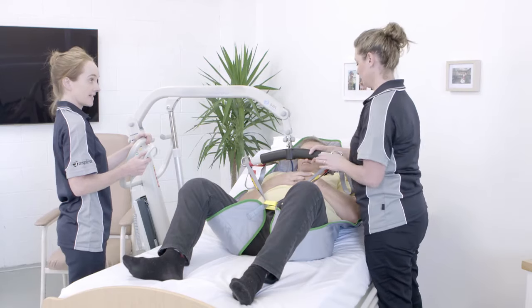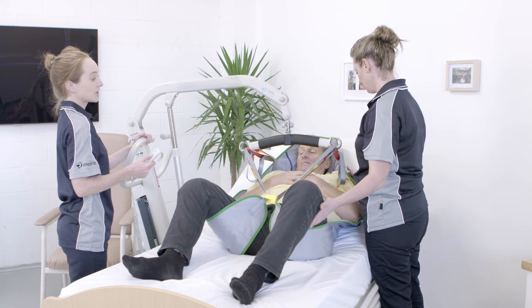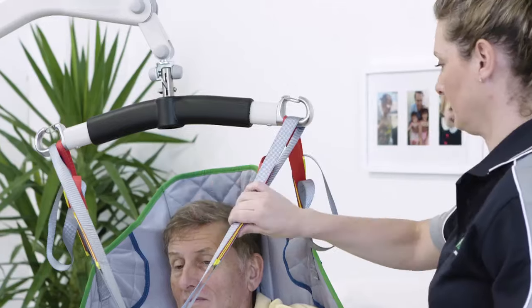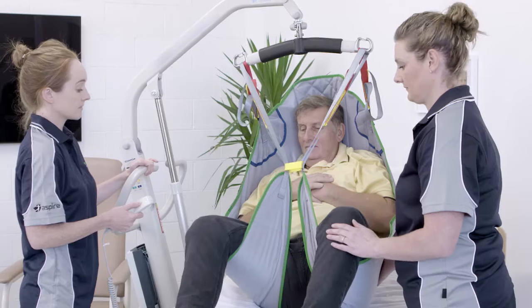Tell the resident what you are going to do and begin the lift, ensuring their arms are inside the sling. When the sling becomes taut and just before their body leaves the bed, check that all sling straps are still securely sitting in the spreader bar. If they're not, bring the resident back onto the bed, adjust, then continue your lift.